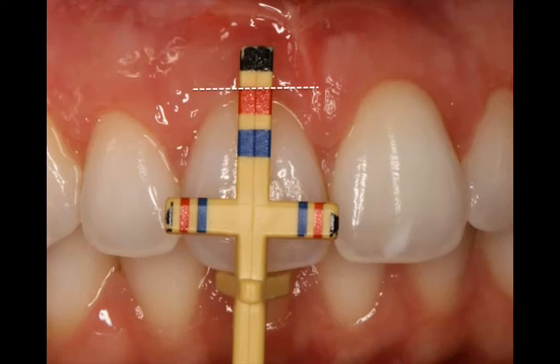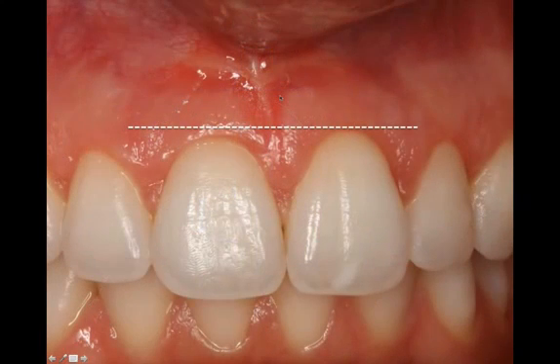I think number 8, I was probably a little bit too shy. I mean, we have some tissue that possibly relapsed. So I'm not 100% symmetrical. A possible reason for that is either I was too conservative with the bone reduction or with the initial excision. So you have the option to go back and basically remove a little bit more tissue, a little bit more bone, and get your result even more perfect.